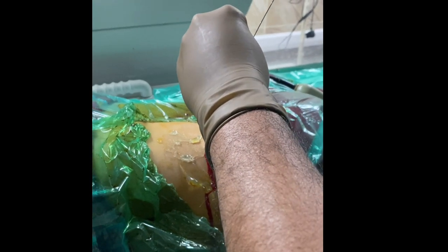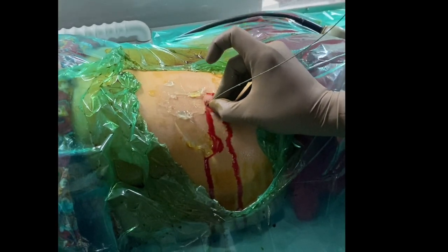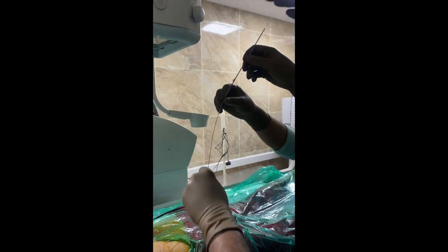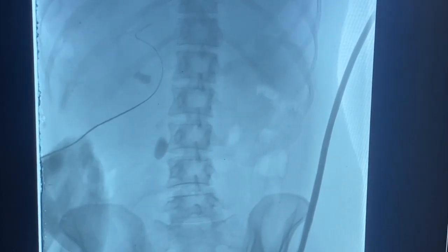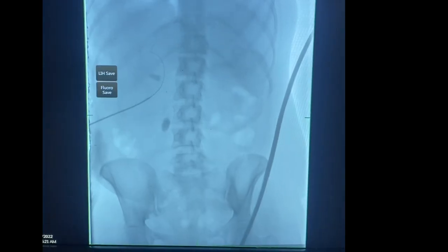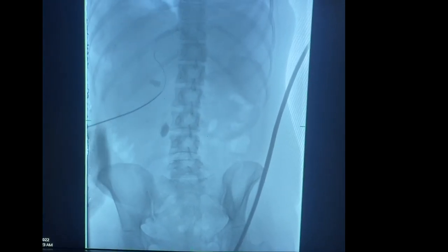Keeping the guide wire in place, tract dilation is begun. A small stab incision is made at the entry site; some bleeding is noted due to the perinephric hematoma. Initially, a 6-French PTFE dilator is passed under fluoroscopic guidance, followed by an 8-French dilator to adequately dilate the tract.